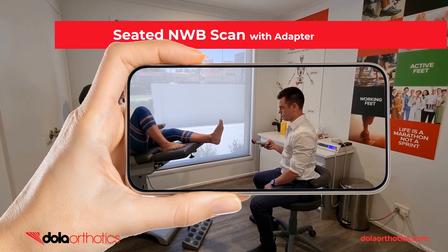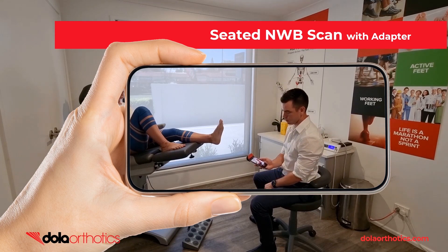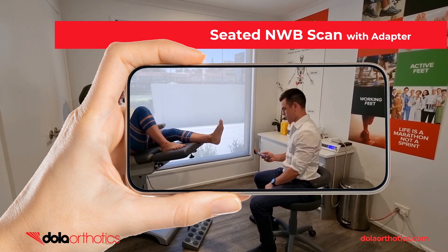Here is a demonstration of the iPhone with Dollar iScan adapter being used to capture a seated non-weight bearing foot as positioned by the clinician or as strapped in treatment directed testing. The adapter provides easier visualization of the screen during the scanning process, allowing the clinician to remain seated.